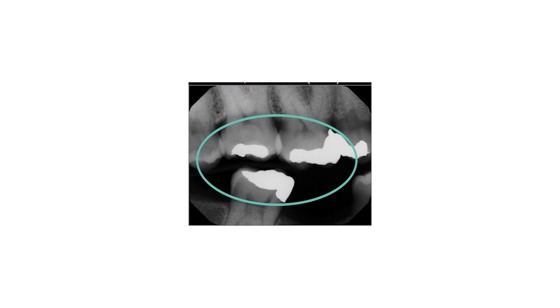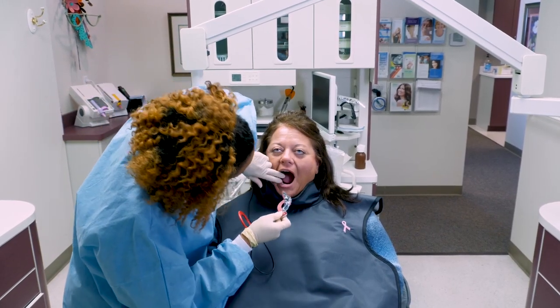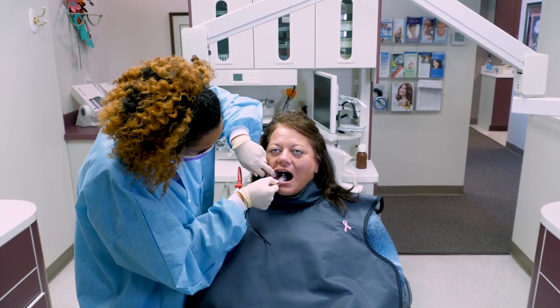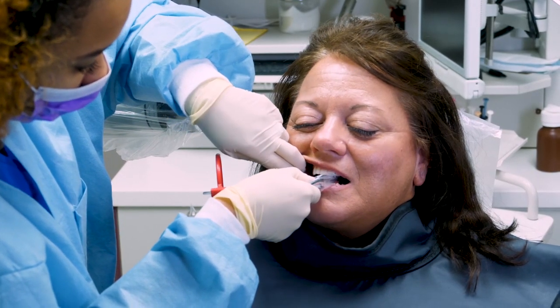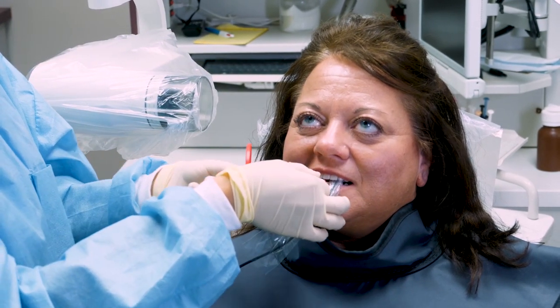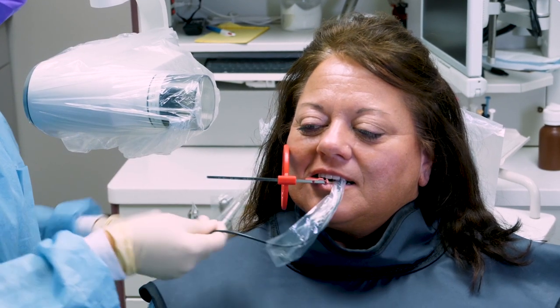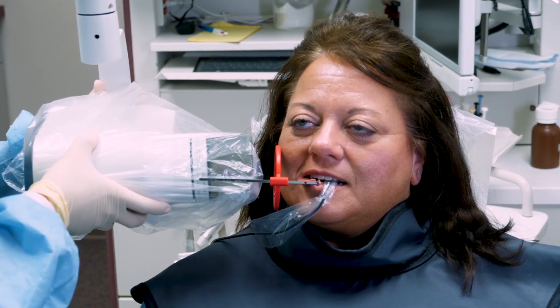Procedural steps for receptor placement and exposure of the molar area on the right side of the mouth include: place the XCP with the unexposed receptor in the patient's mouth on the right side, between the tongue and the teeth in the molar area. Instruct the patient to slowly bite down on the bite block. Slide the XCP ring along the bar until it is as close to the patient's face as possible. Position the tube head parallel and perpendicular to the ring and expose the receptor.